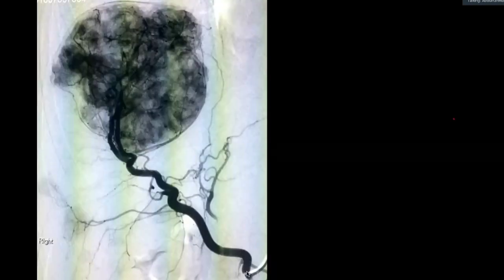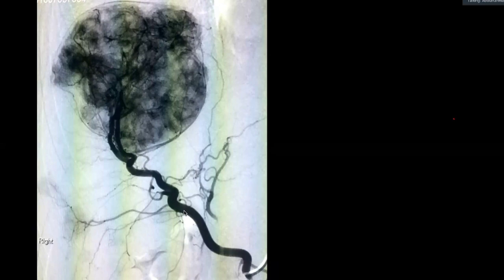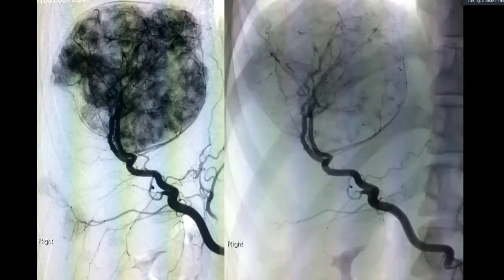And here's a large neuroendocrine tumor, liver metastasis. You do not see segmental liver arteries like this. These are very, very huge, and this is because it's a hypervascular neuroendocrine tumor. So this is a selective angiogram of, let's say, some of the segment 7, 8 branches of the right hepatic artery. These were then embolized with the particles I've just shown you on the previous page, and this is the final result. You can see that the tumor is completely devascularized and the vessels are preserved. And on follow-up CT scan, this indeed shrunk with time. So this is the principle of chemoembolization, bland embolization for liver tumors.